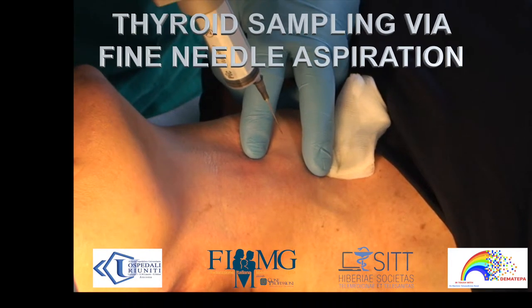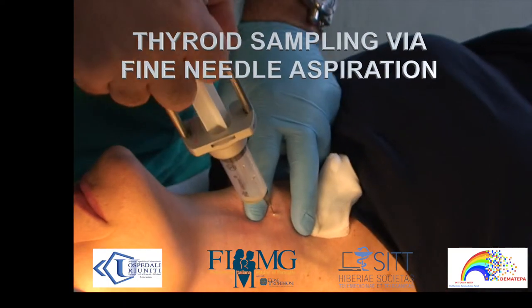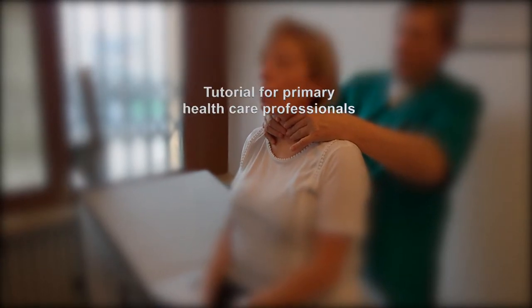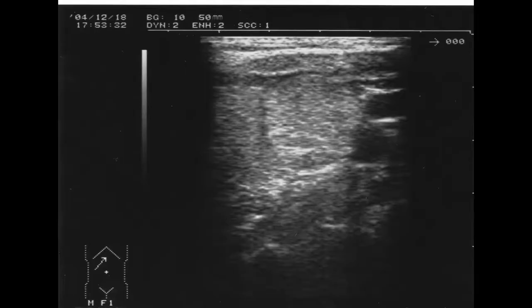Fine needle aspiration biopsy of the thyroid is performed only for neoplasm-suspected lesions. Both physical examination and ultrasound scan imaging are mandatory to recommend such tests.